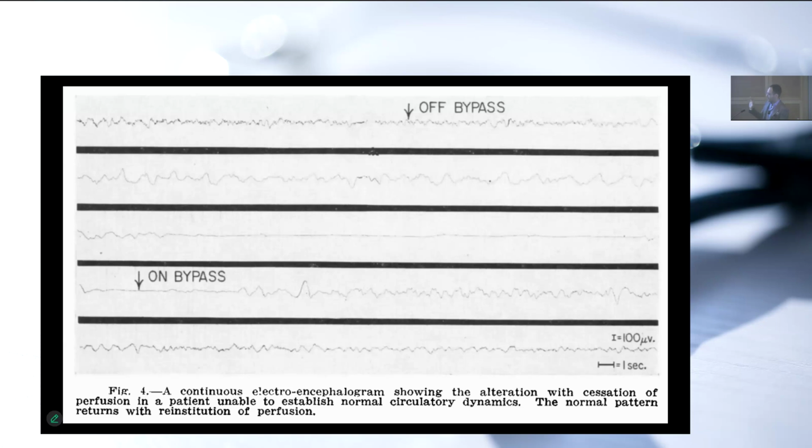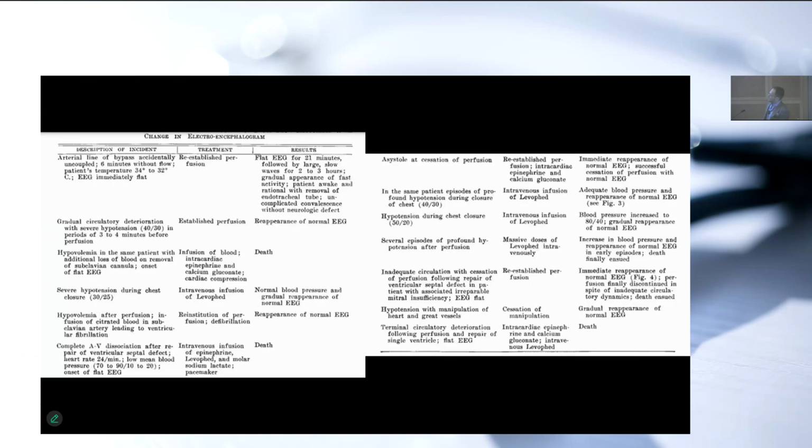So this is exciting. You can imagine this paper was extremely exciting. It was cited several hundred times, which for a paper in the 1950s is quite impressive. The list goes on and on in their paper of abnormalities that they viewed under certain circumstances, all related to misadventures, disconnections of stuff. Oxygenator fails, things get cross-clamped and people forget to uncross-clamp them. They go on pump, but the solution is cold and they're perfusing the brain with cold saline before any blood has come back. RAP was not a thing. Nobody was priming with warm blood. This is like a different time.